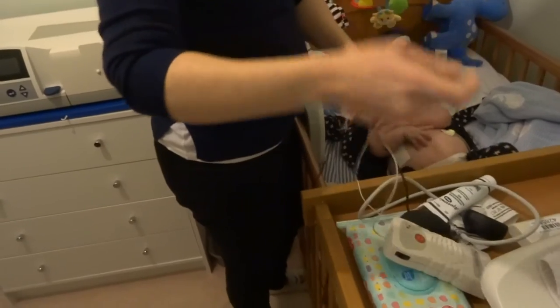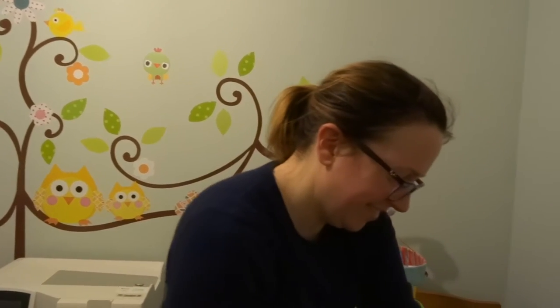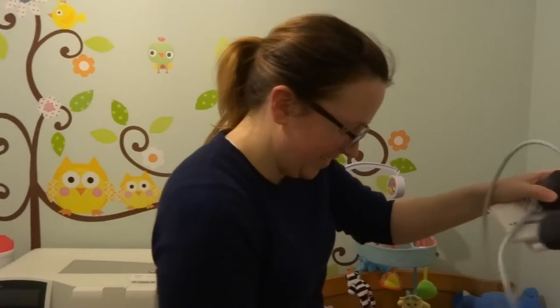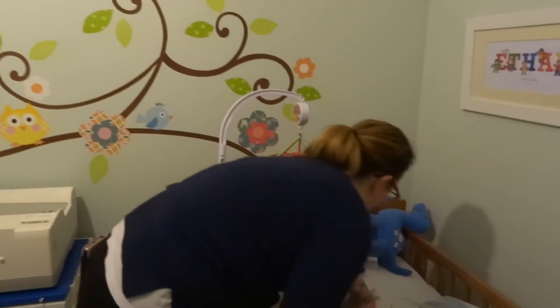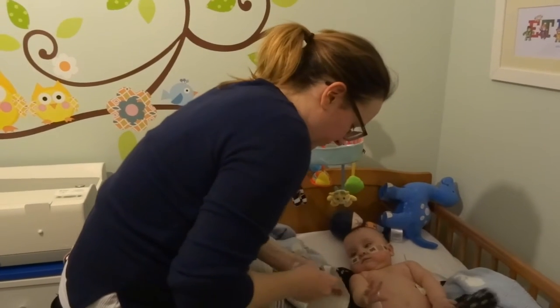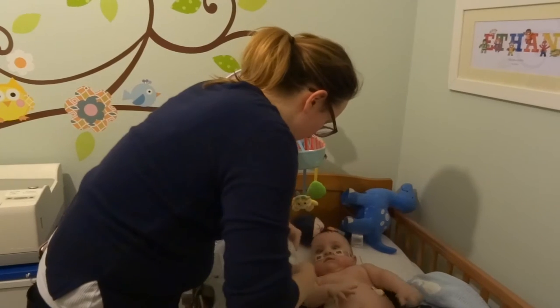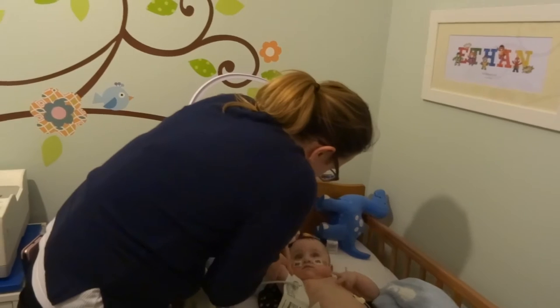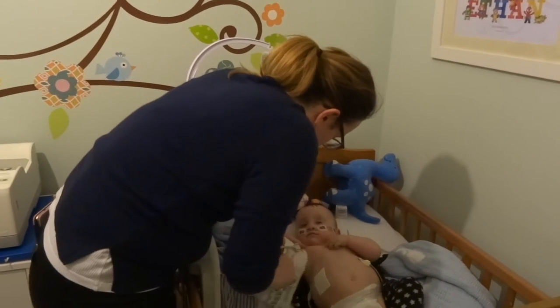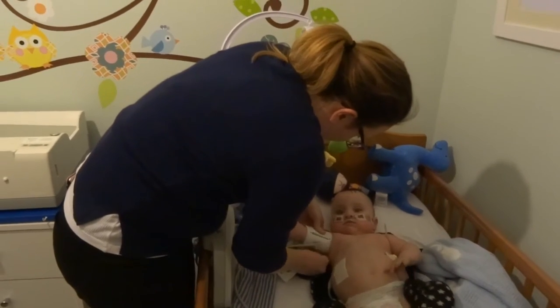It's worth pointing out that we don't always do this together — in fact, we rarely do it together. One of us is always doing something else, looking after the rest of the children, getting them bathed, that sort of thing. So this is normally a one-person job; however, today someone needs to hold the camera.